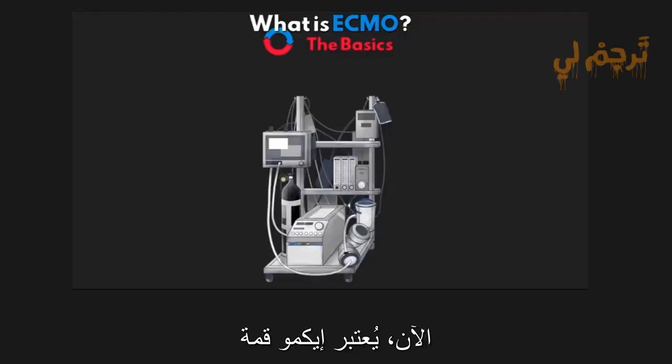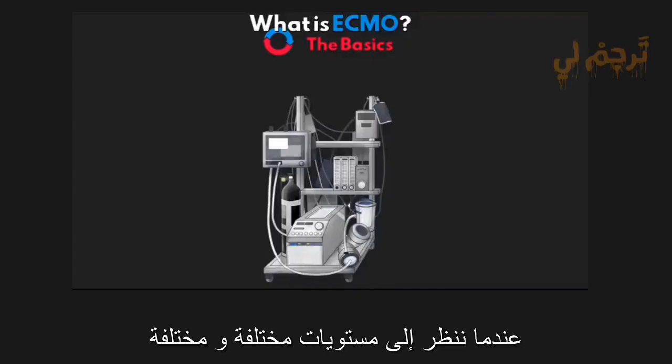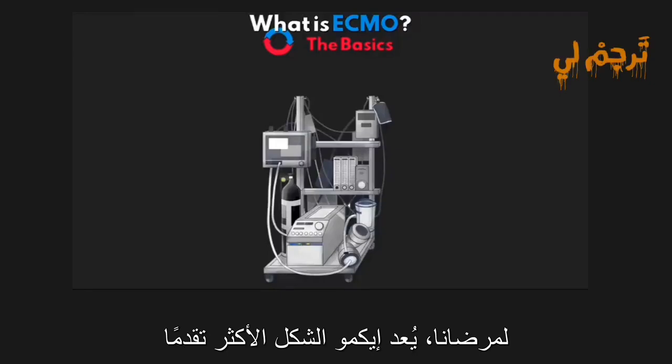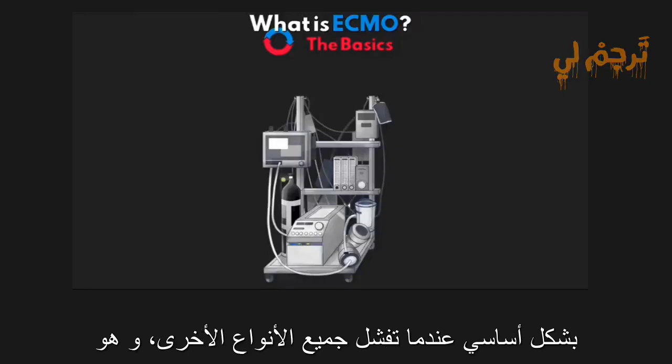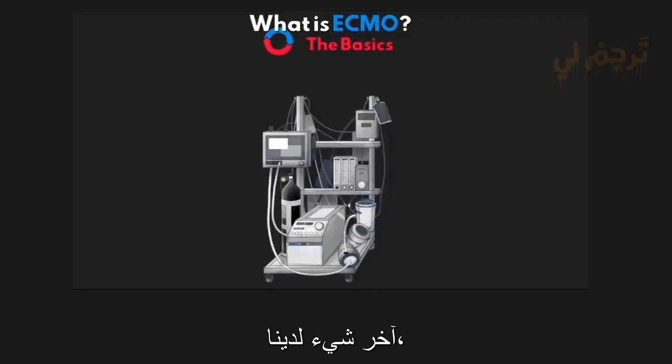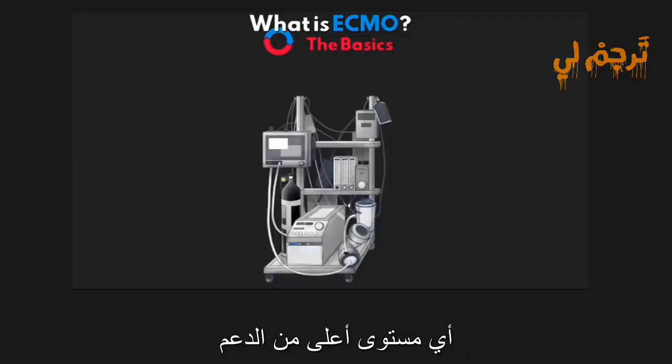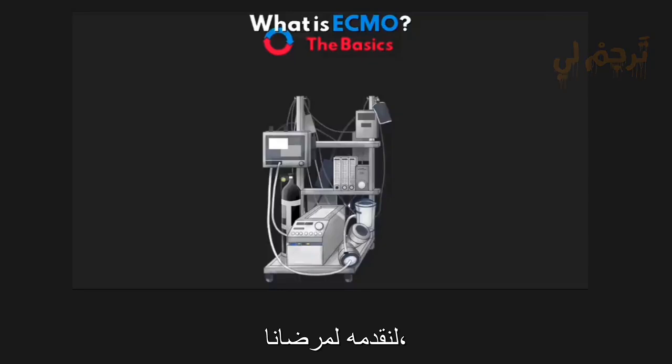Now, ECMO is considered the pinnacle of life support. When we look at different varying levels of life support that we can offer to our patients, ECMO is the most advanced form. Essentially, when all others have failed, ECMO is the last thing that we have left. And if ECMO is not enough, then we really don't have any higher level of support to offer our patients.